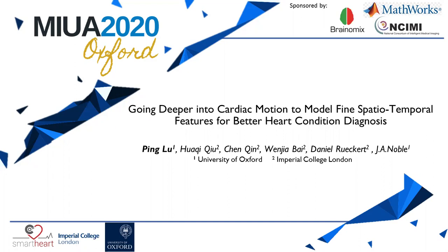This paper shows that deep modeling of subtle changes of cardiac motion can help in automatic diagnosis of earlier onset cardiac disease. We model left ventricular cardiac function in MRI sequences based on a hybrid spatio-temporal network. Temporal data over long time periods is used as inputs to the model and delivers a dense displacement field for regional analysis of left ventricular function.